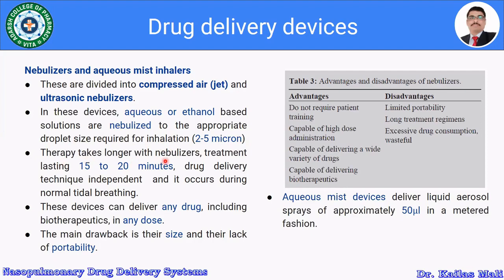Therapy takes longer with a nebulizer. When we use a nebulizer, the treatment time is approximately 15 to 20 minutes, which is much more as compared to pressurized metered dose inhalers and dry powder inhalers.